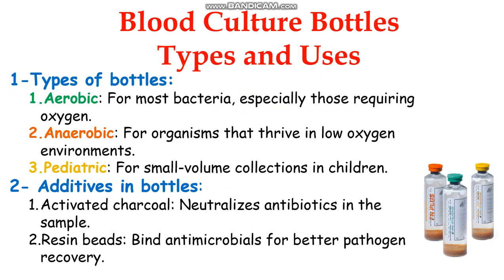Each bottle contains specific additives to enhance pathogen recovery. For example, activated charcoal neutralizes antibiotics that may already be in the bloodstream, while resin beads help bind antimicrobials, increasing the likelihood of detecting pathogens.